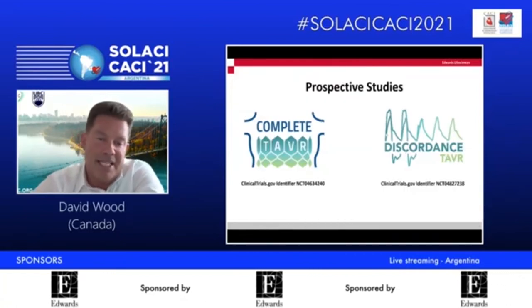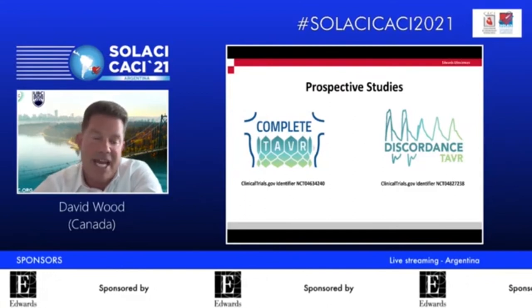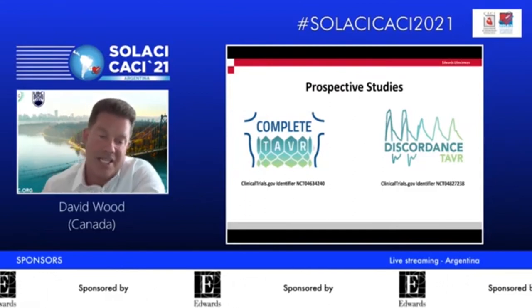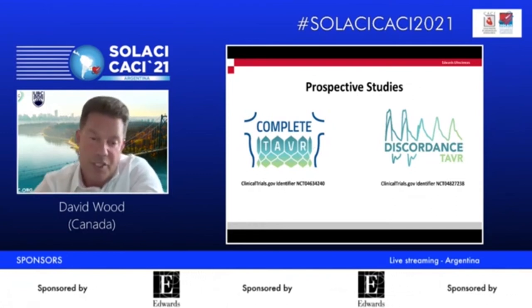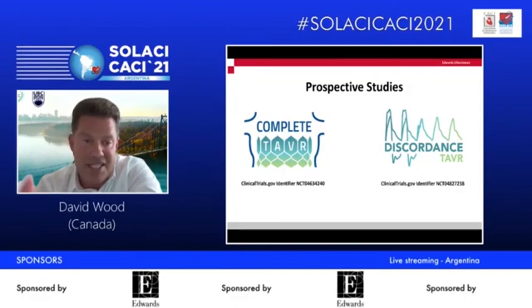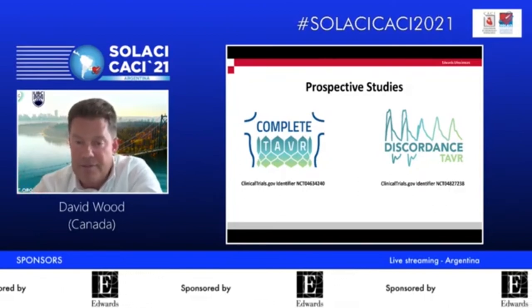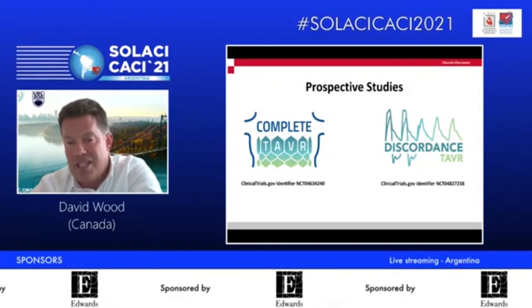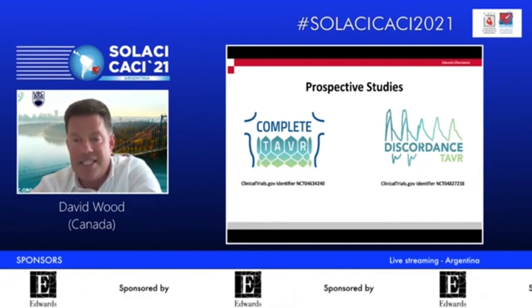So two prospective studies in my last minute here. Complete TAVR, 4,000 patients. Discordance TAVR, 50 patients. Complete TAVR, we won't have the data until 2026, but it will be very compelling both for coronary, whether we should revascularize those arteries, as well as whether coronary access is an issue with a short frame valve. You can see that from the logo. And Discordance TAVR, 11 sites, 50 patients.